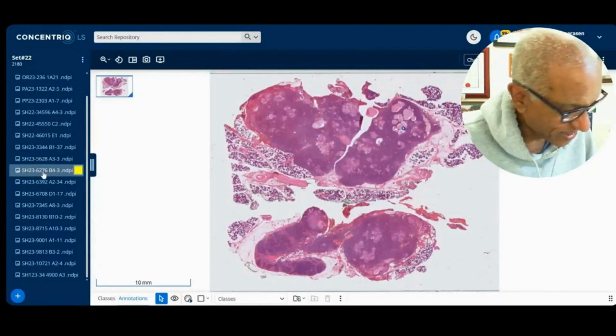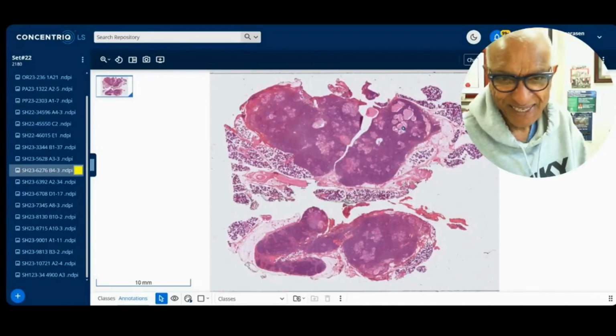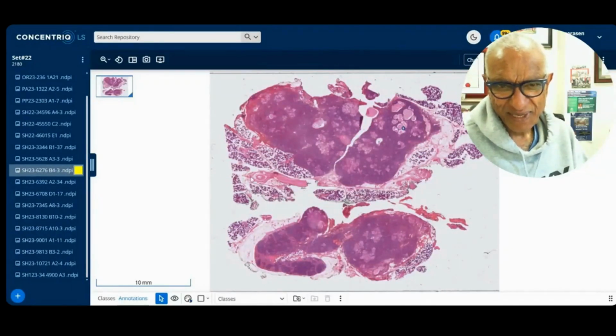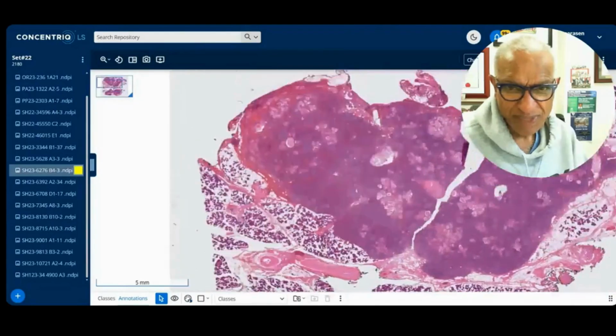We're moving on now. We're going to parotid gland. All right, so all you salivary gland lovers out there, here we go. Nice circumscribed mass, fairly well circumscribed, a little irregular. And then here is the salivary gland. That's a parotid mass. It's a 3 centimeter parotid mass. So let's go and look at this.